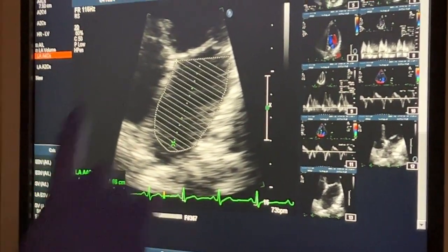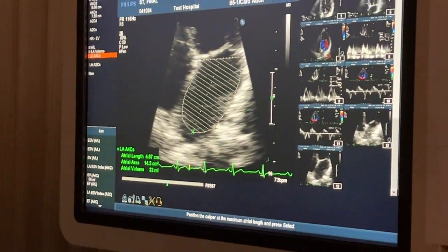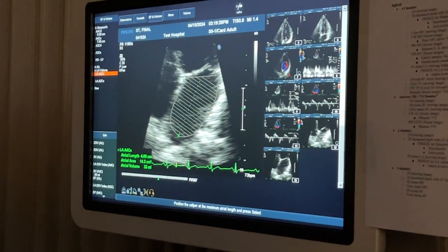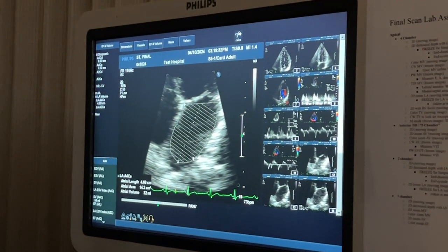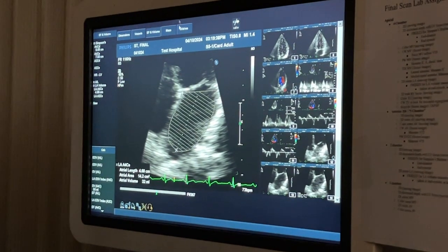This is going to be your length from your mitral annulus to the top, technically, but the bottom of our screen. I'm just going to put it right at the peak of this bullet shape. And now I can print and it'll save. But it didn't have me do that last step. I don't think that those machines have the left atrial length, so don't worry about it if you don't get that option. If you're feeling super ambitious, you can just do a caliper on it.